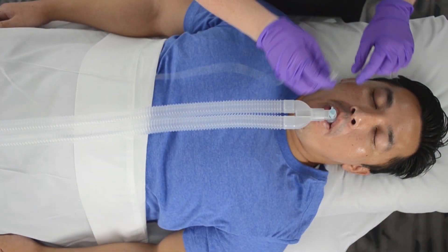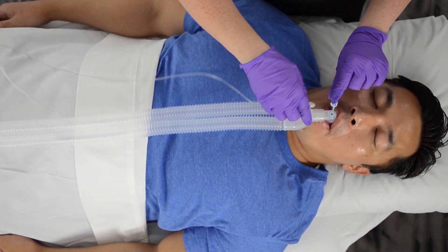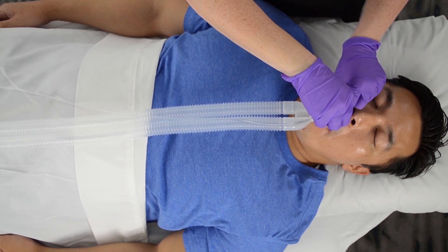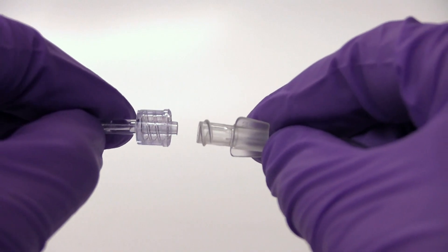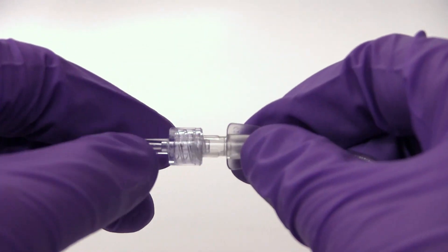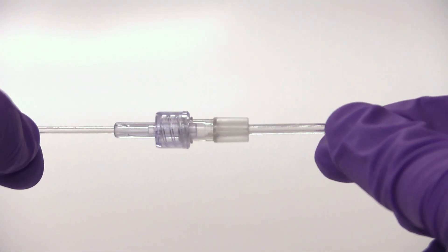Additionally, the monitor is compatible with patients who are ventilated or intubated, where the use of the included adapter might be needed. To connect the cannula to the sample line, insert the male connector into the female connector and rotate one half turn.